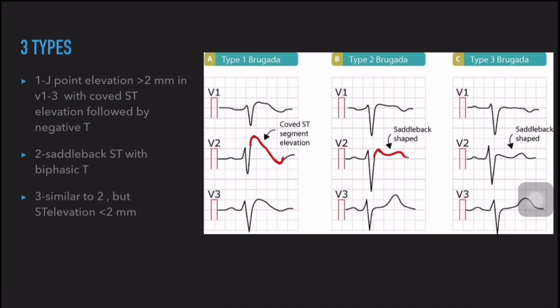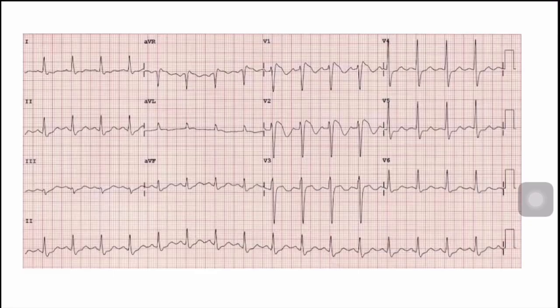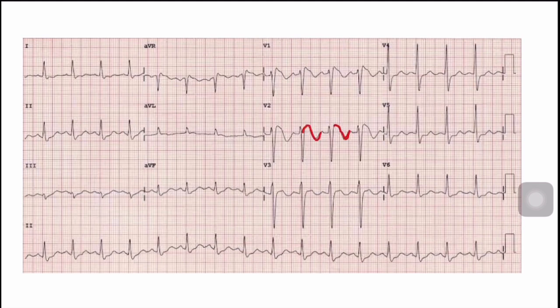The most important pattern is the Type 1 pattern. Don't ever miss this Type 1 pattern when a patient presents with syncope. In this ECG, we can see in leads V1 to V3 there is a coved ST segment elevation with a negative T-wave — this is a Type 1 Brugada pattern.